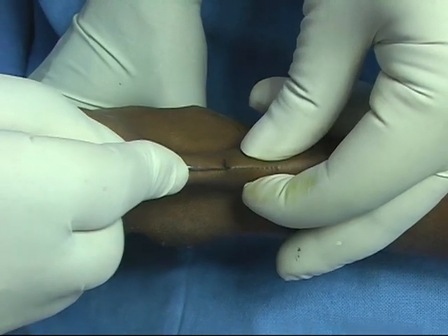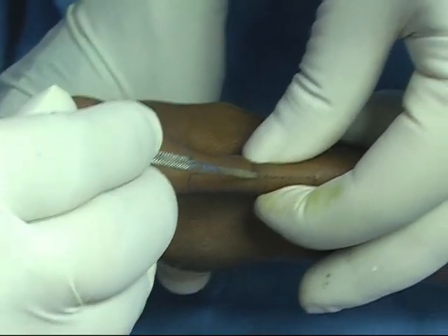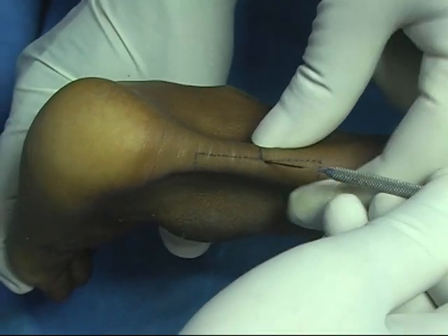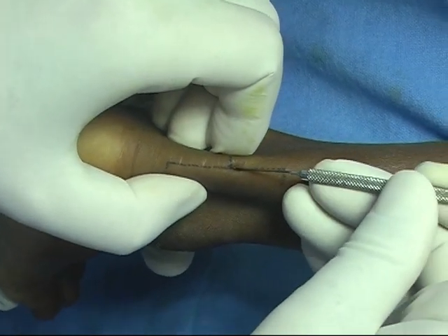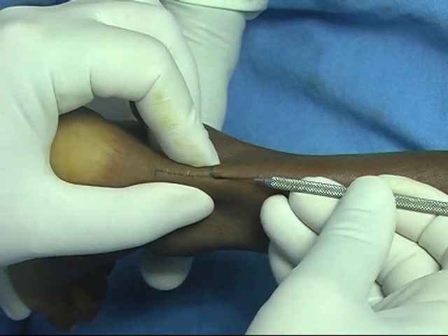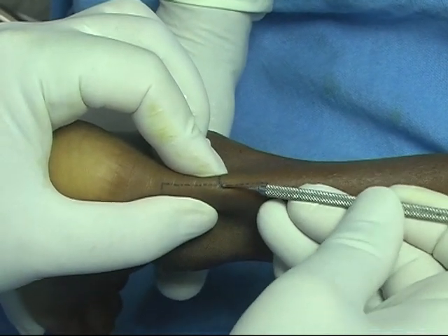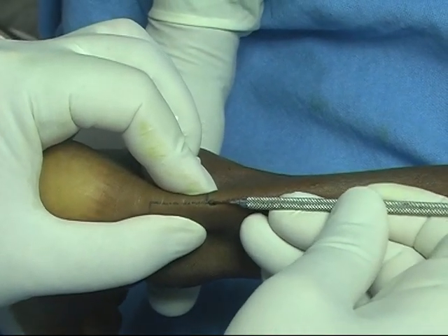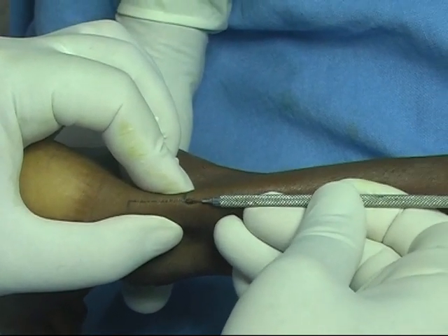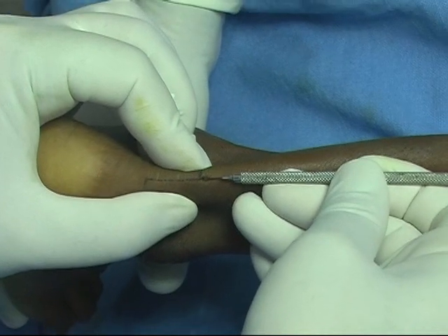We have split the tendon in the midline. Withdraw the knife, turn it up, and insert exactly in the midline in a coronal direction. Insert it and split the tendon exactly in the midline. Be very careful here — just keep the knife tangential. Don't cut the skin. Just break the major part of the fibers longitudinally.